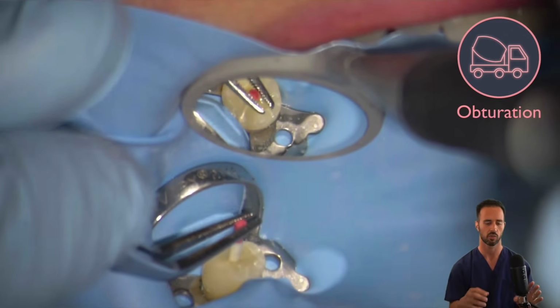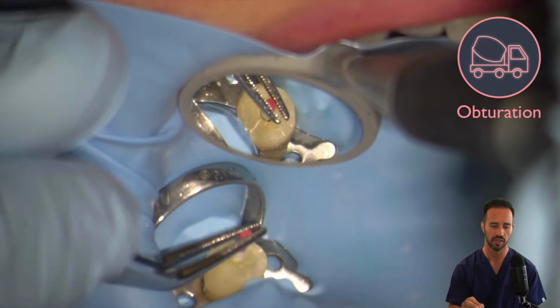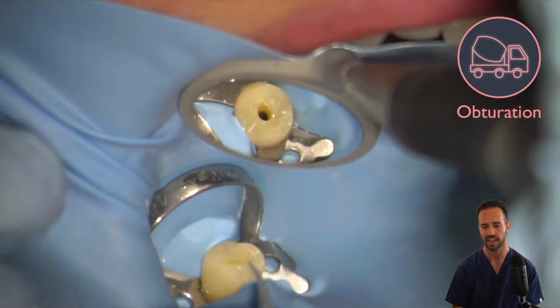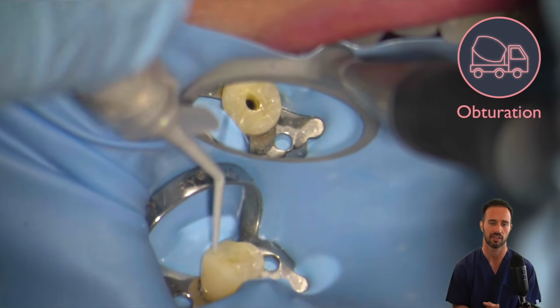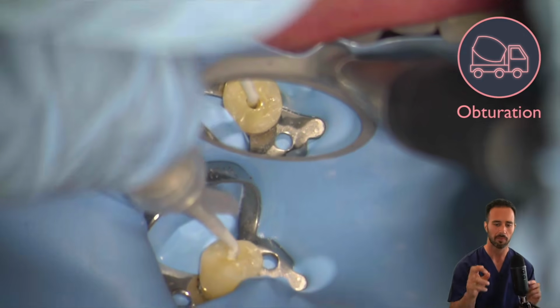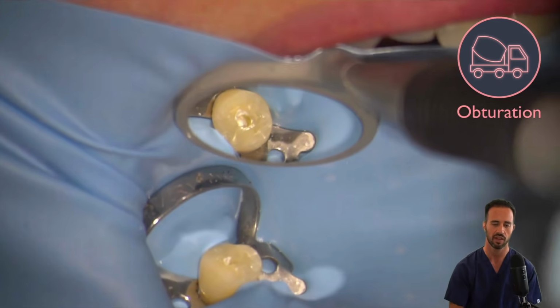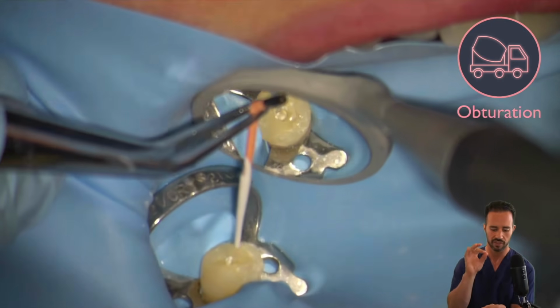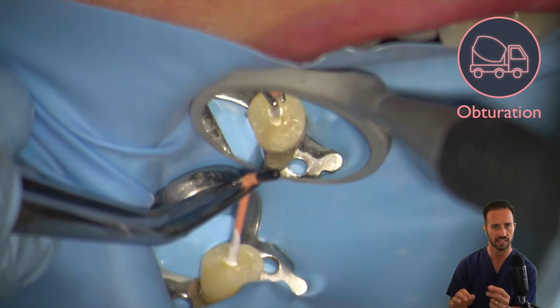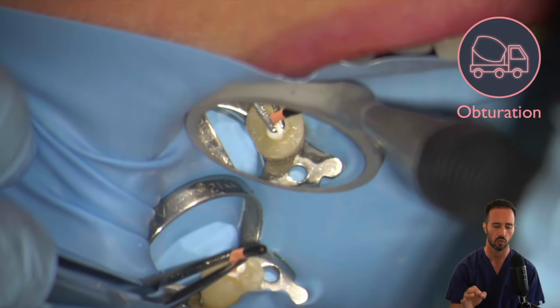So we're gonna start with our ProTaper F2 paper points. That's the red that you see there, and those are nice because you really only need one of those to get the canal nice and dry. And this is our bioceramic BC sealer that we're going to squirt right into the canal passively, so we're not squirting anything out. And once we've dunked the cone into the tip of the sealer, we're going to go ahead and seat that cone all the way to length.